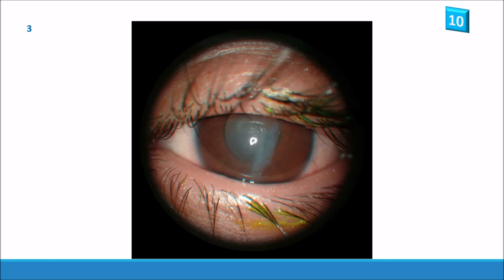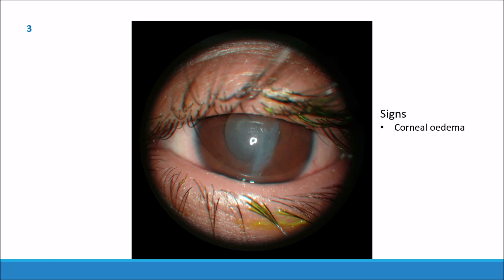And the next slide. Here we can see a vertical grey opacity which is corneal oedema and the patient here has corneal hydrops from keratoconus.